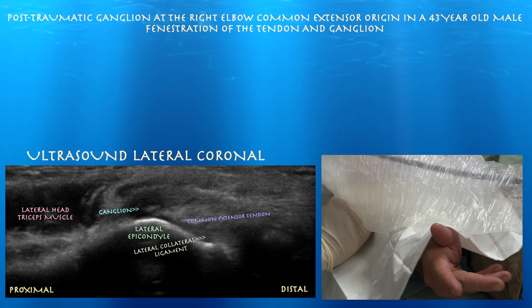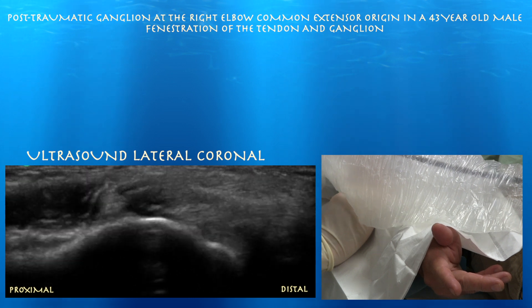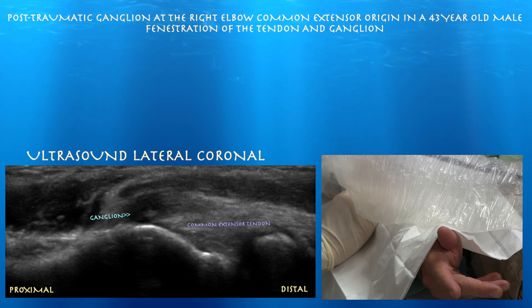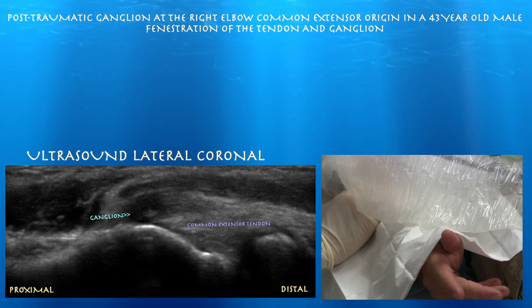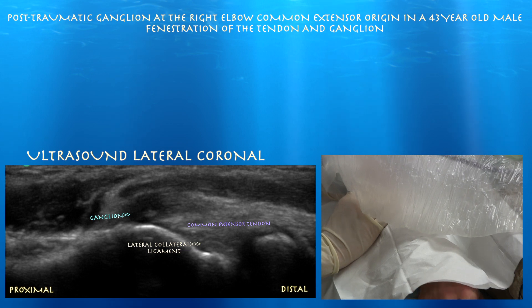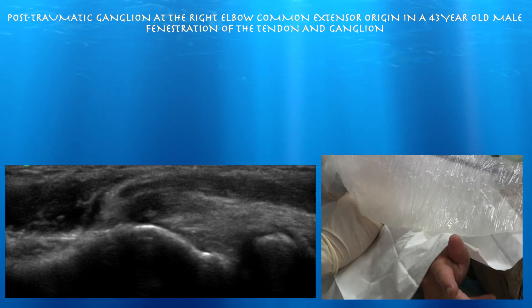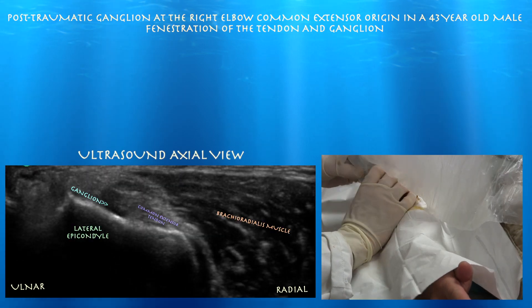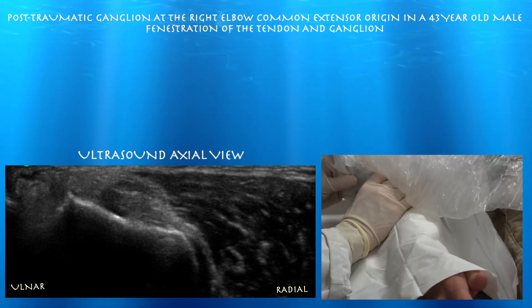And here it's more clear — this ganglion — again at the origin of the common extensor tendon. Here's our axial view where you can see the ganglion again. This was something that I palpated on exam where I felt a nodule right near the lateral condyle, and that's where it was most tender, which led me to the whole concept of a ganglion.